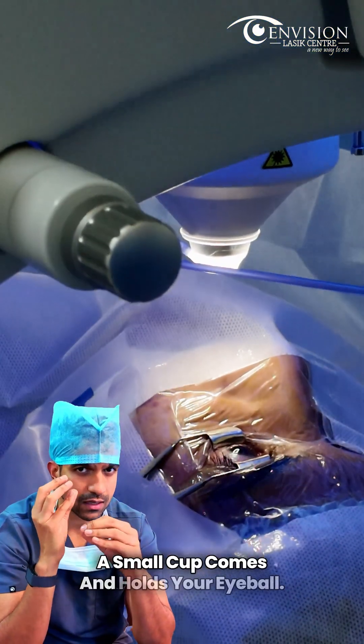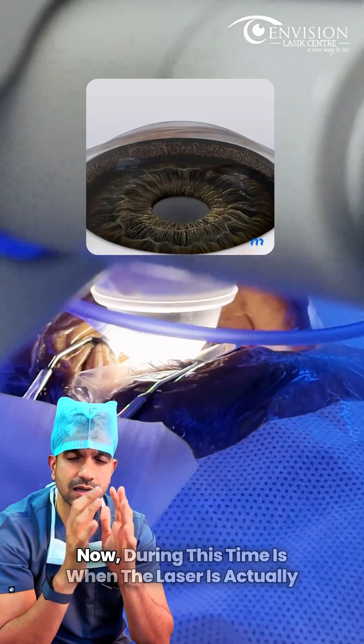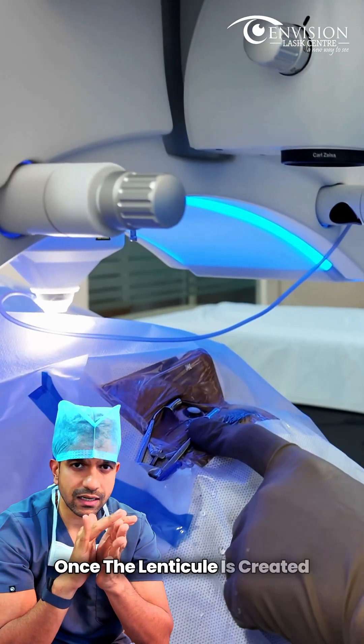Then a small cup comes and holds your eyeball, and the laser time is about 25 to 30 seconds. During this time, the laser is actually creating the lenticule.